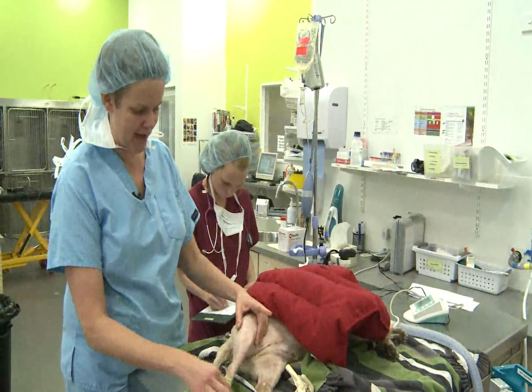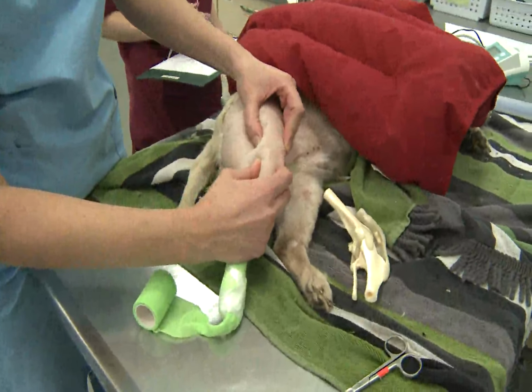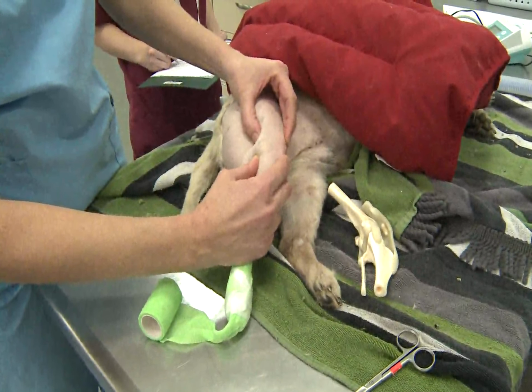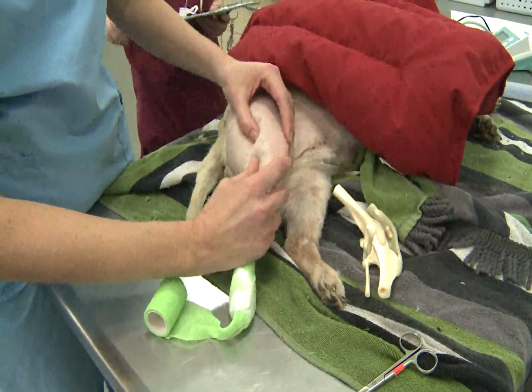And we can see, having a wee look at his knee here, he's got quite a lot of instability between the two wee bones of his knee. You can see that moving back and forward there, and it shouldn't really be moving at all. There should be no movement between the shin bone here and the thigh bone here.